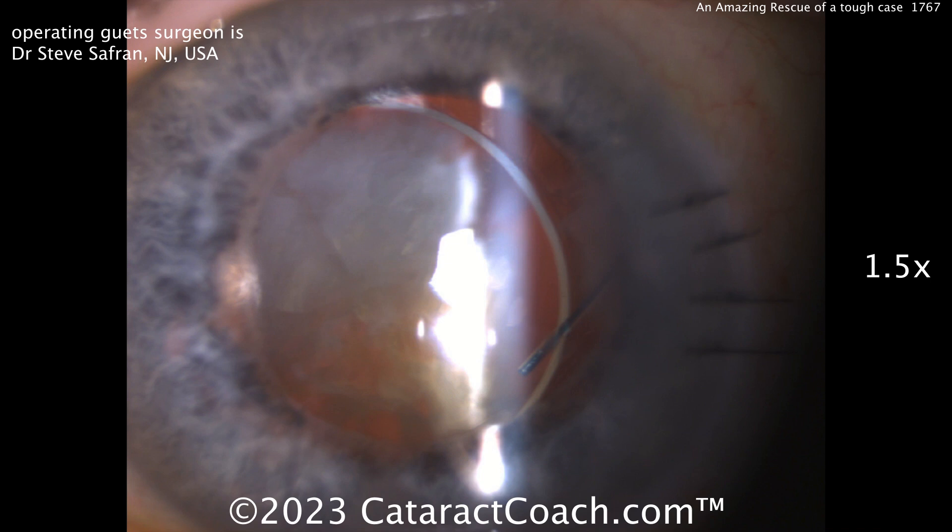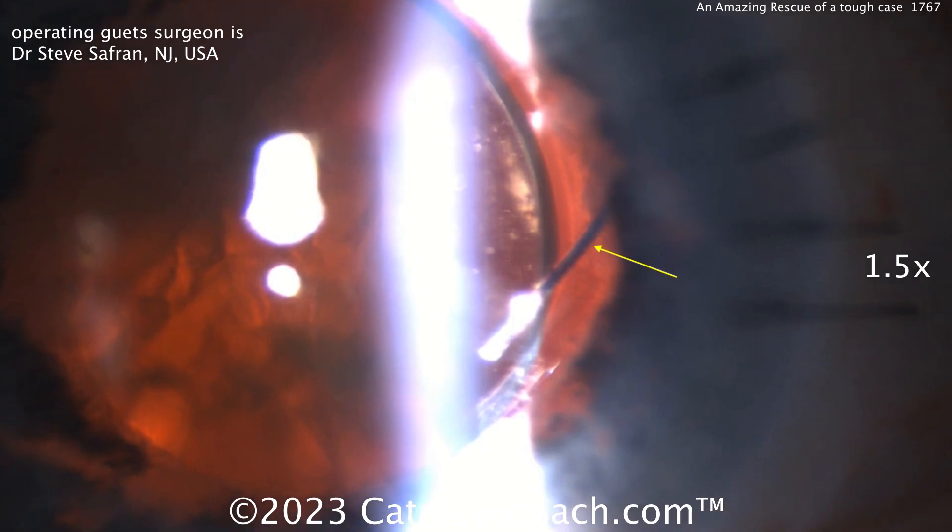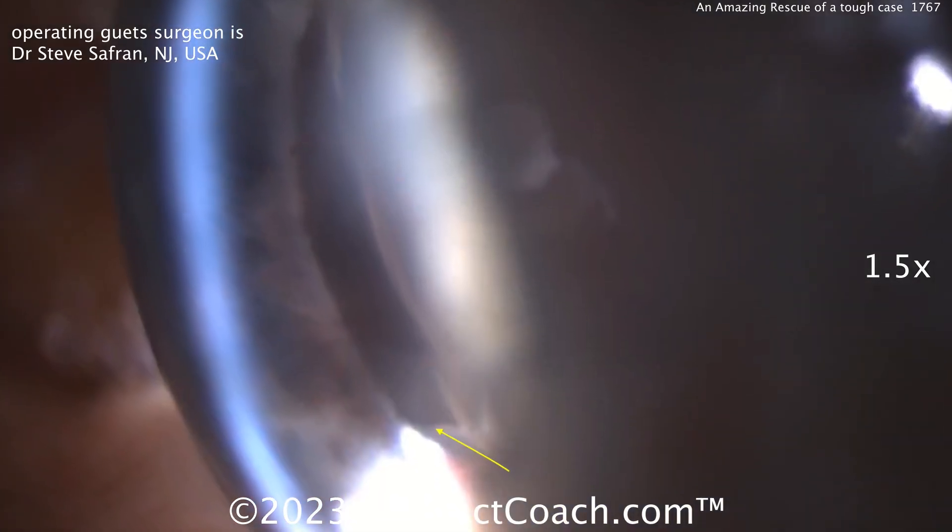Here's the pre-op: you can see a dislocated IOL, nuclear material behind that optic, one haptic in front of the capsule and one behind the capsule.